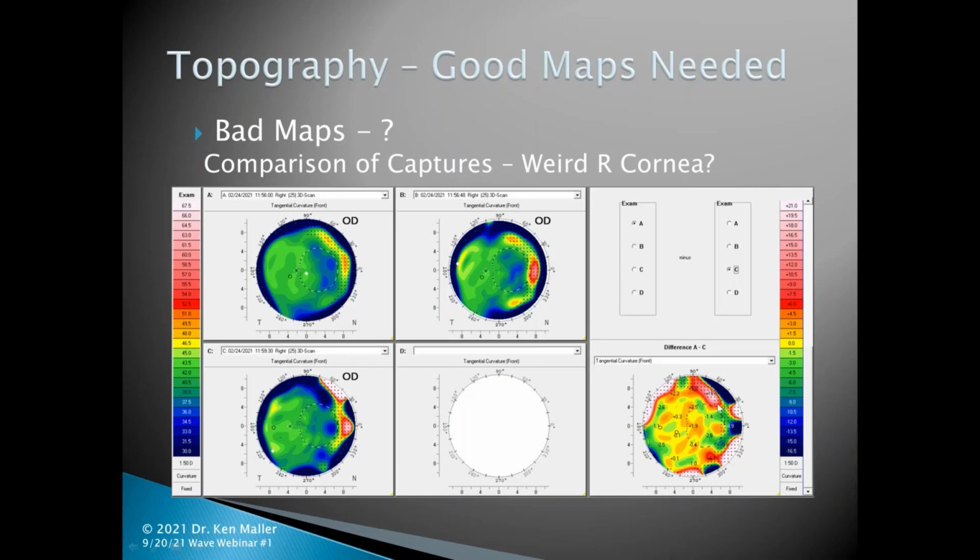And take a look at what this difference map shows. And we could see that we have a range of error that's in the white range up over here and over here, which is at 21 plus 21 diopters. But we're also down in the darkened range here, somewhere around the minus 15, 16 diopters. So we actually have a range showing a difference here of better than 35 diopters difference in curvature.